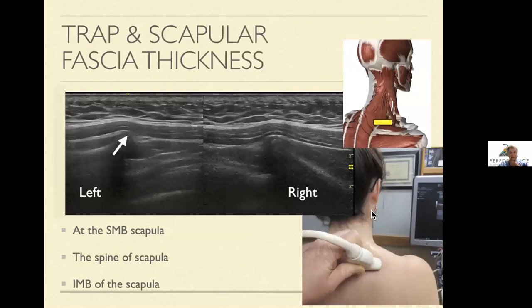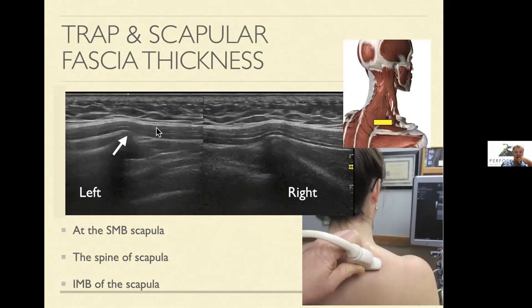Once you've completed that assessment looking for muscle atrophy and symmetry, switch to a true axial plane to the thorax, long axis to the trap. This shows middle trap fibers, infraspinatus, medial border of the scapula, rhomboid, and rib with lung underneath. The fascial component can get thickened with overhead repetitive use. Take measurements of the trap and check that it looks symmetrical, and make sure the rhomboid echo texture and structure looks normal.